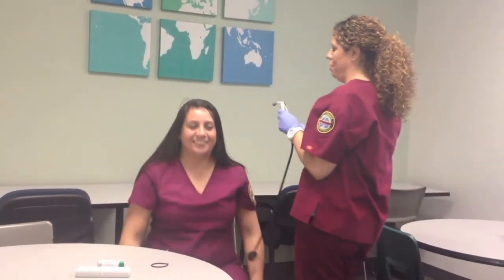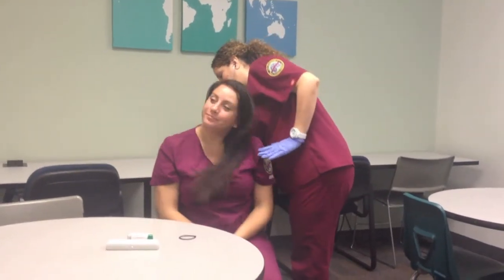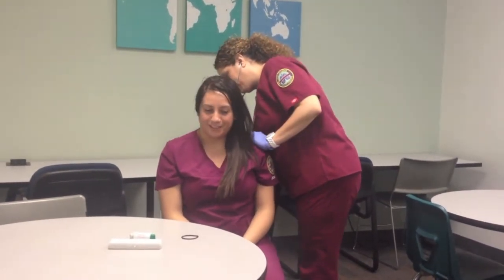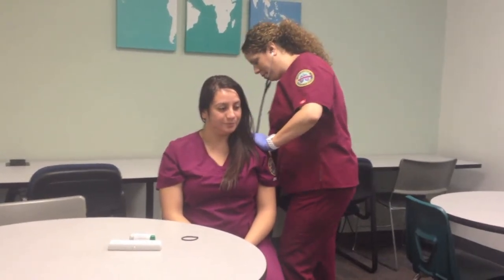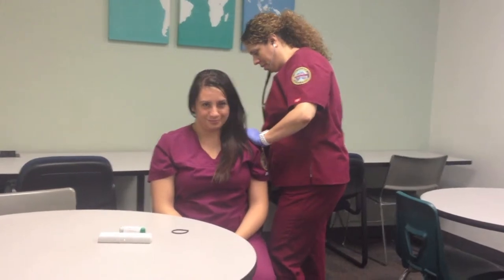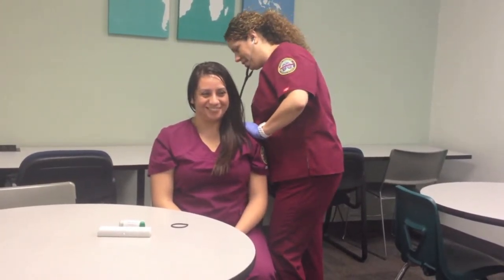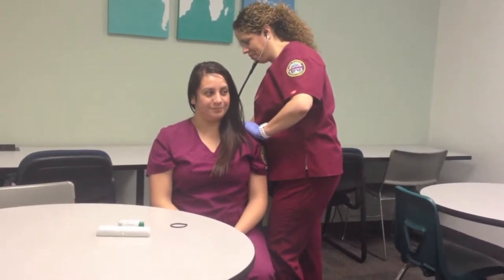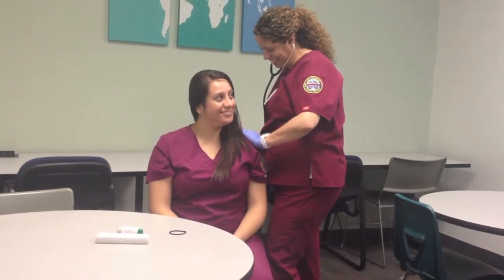I'm going to go ahead and listen to your breath sounds. Every time you feel the stethoscope, sit up straight, and every time you feel it touch your back, I want you to breathe in nice and deep for me. Okay. Deep breath in. And breathe. Again. One more time. Last time.